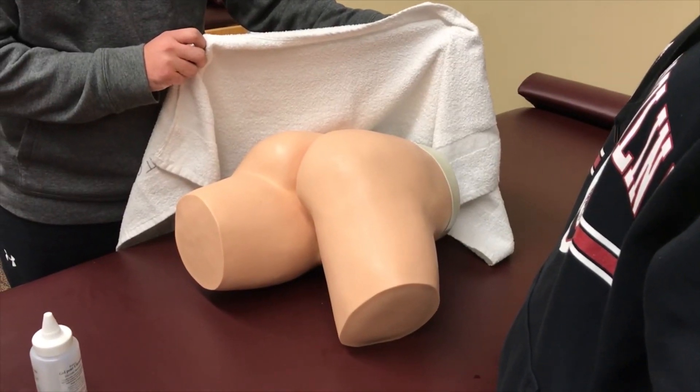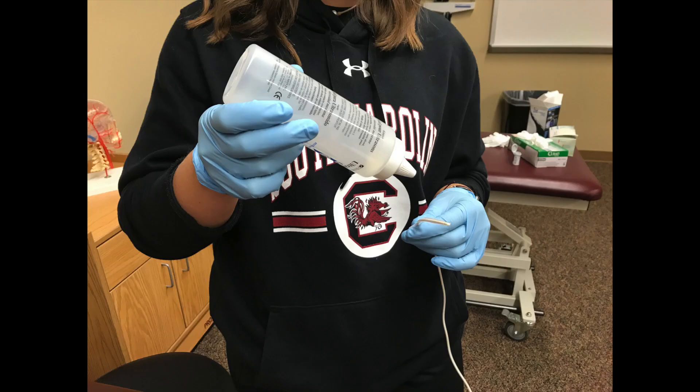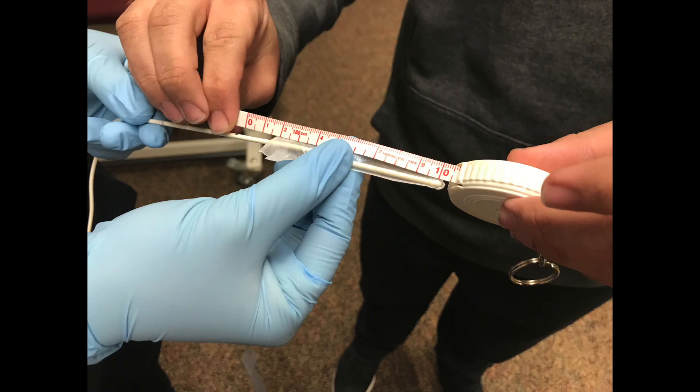You will then take a towel and cover the area you are about to expose. Next, pull the patient's pants down while having the patient bend one knee up. You will then lubricate the thermometer, measure 10 centimeters, and insert it into the rectum.